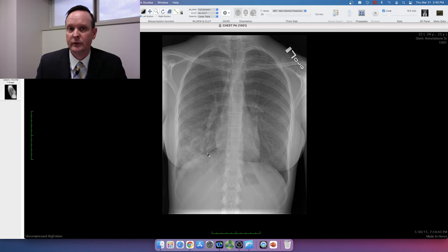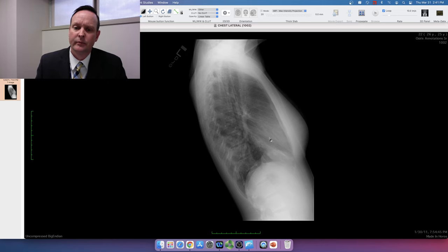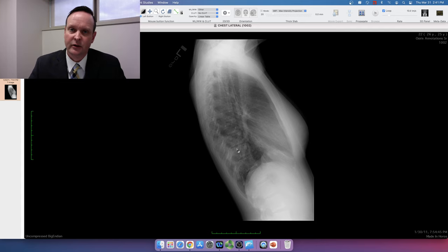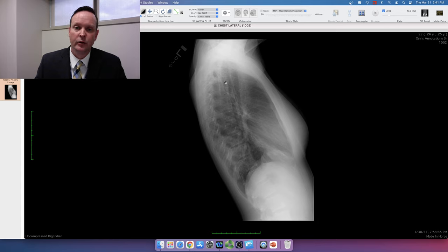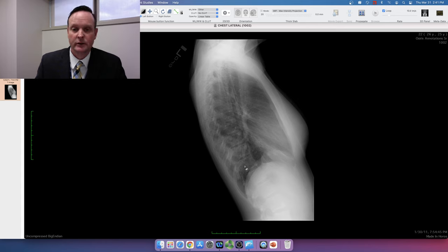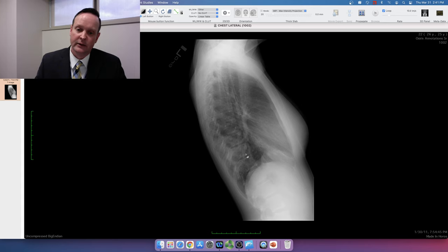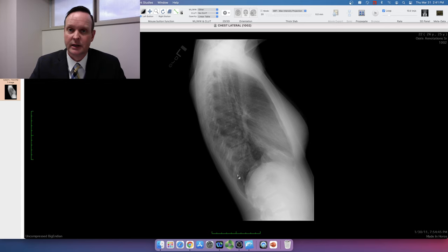I know that part of this opacity is up against the hemidiaphragm at the dome of the diaphragm, and that's a classic location for the right lower lobe. On the lateral exam, I see that consolidation approaching the hemidiaphragm anteriorly, and posteriorly I see an increased opacity. Generally, the thoracic spine goes from increased density to decreased density cranial to caudal. If it increases in density inferiorly, that tells you there's a process in the lower thorax — that's the spine sign.